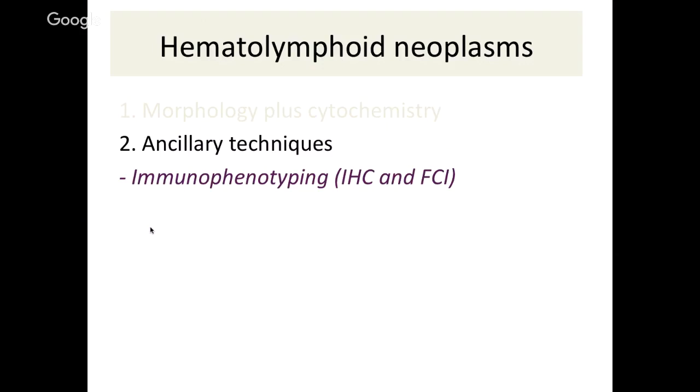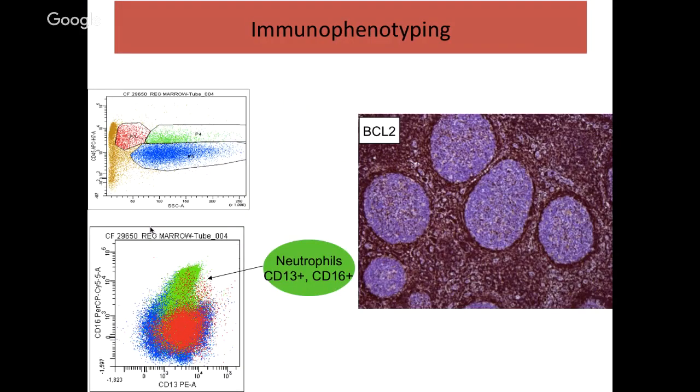Second, if you look at this slide, on the right side, this is an immunohistochemistry slide stained for BCL2. It shows an H&E-type section, a paraffin block section, which has been stained with immunostains for BCL2. All the brown cells are positive for BCL2, and the blue-looking cells are negative. The brown ones are mostly in the T zone, mantle zone, and marginal zone, and some cells within the germinal center. All these big balls are the secondary follicles.